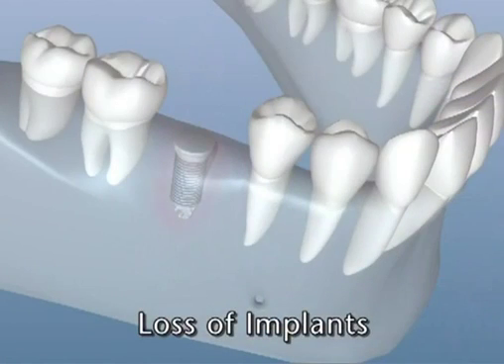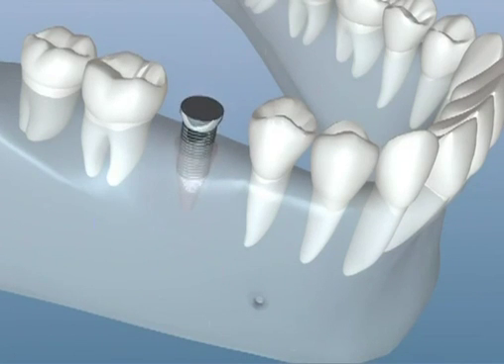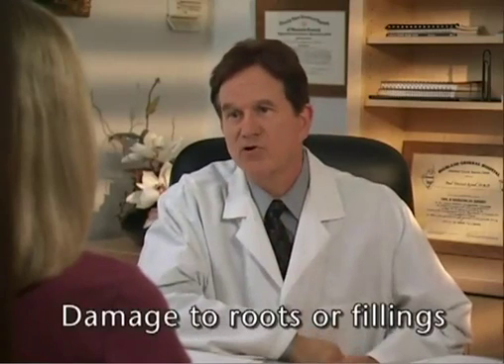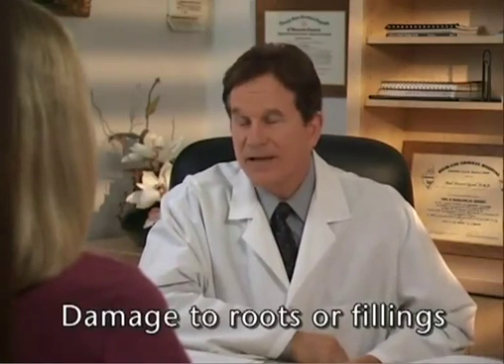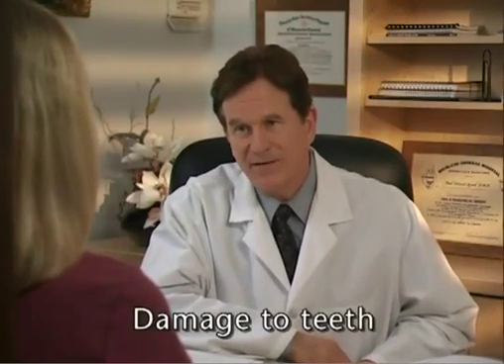Depending on the difficulty of the surgery, there are a variety of risks. These can include loss of the implants due to infection. However, if the implant is lost, we may be able to place a new one after the good bone healing has taken place. Besides swelling and bruising of the face and jaws, risks can include damage to tooth roots, which may later require root canal treatment or result in loss of teeth.